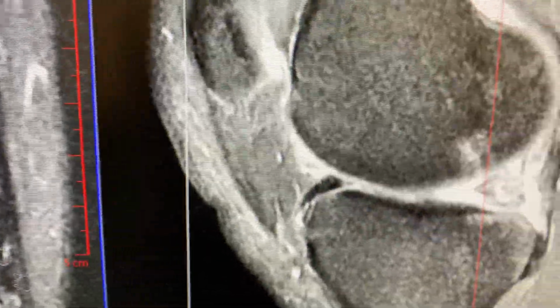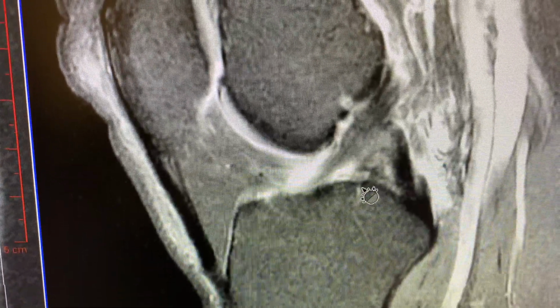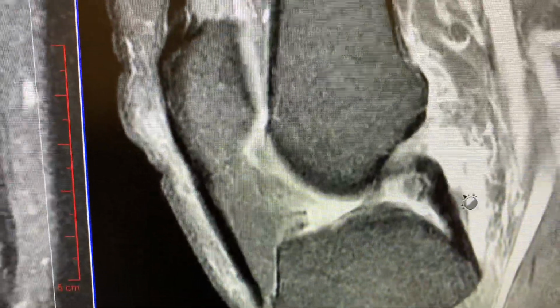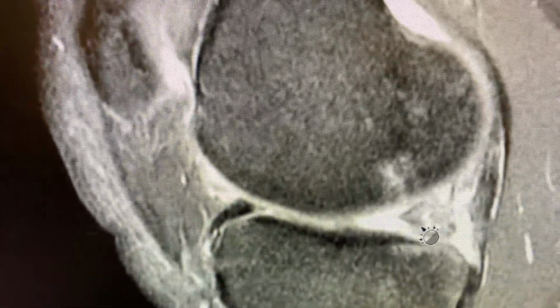When you go on the sagittal view here, you find the PCL. PCL is right there. One click over, there should be a meniscus, but there's not. Ghost sign, the meniscus ghost sign, root tear. There it is. There's a meniscus, and there it's not. That's called a ghost sign of the medial meniscus.